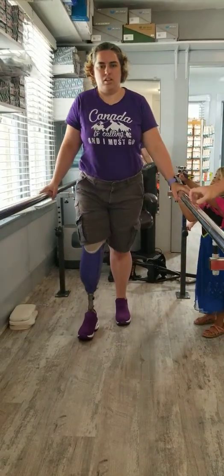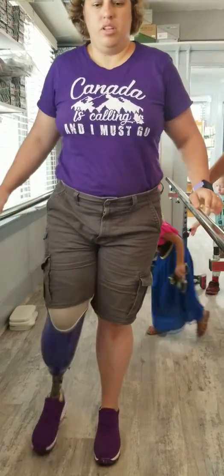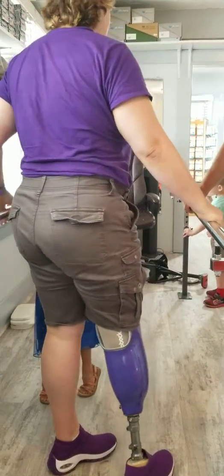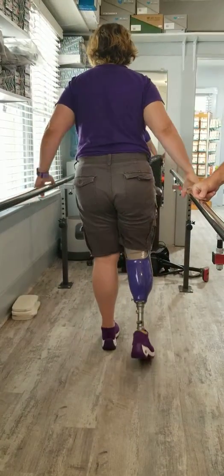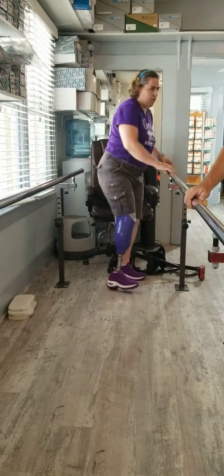But if we want to match the shoe — I don't have another shoe. Well, we'd give you a different shoe here, but it looks funky. Violet, please get out of Mommy's way. It's not going to look funky enough. I think I'd probably prefer the one that's a little more stable. Okay, let's have a seat and we'll change you out.